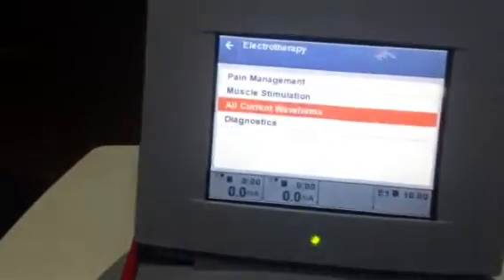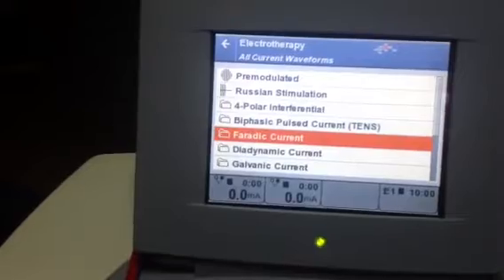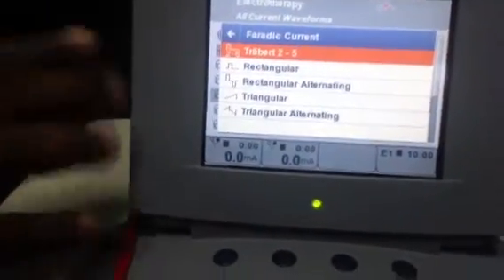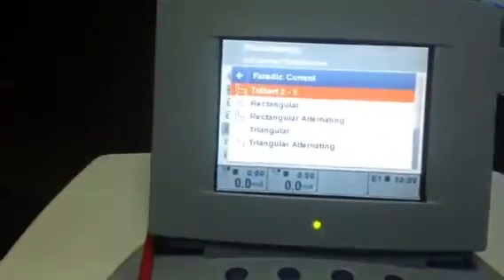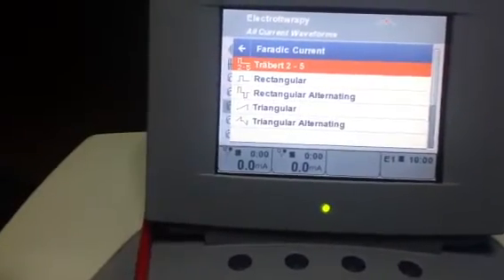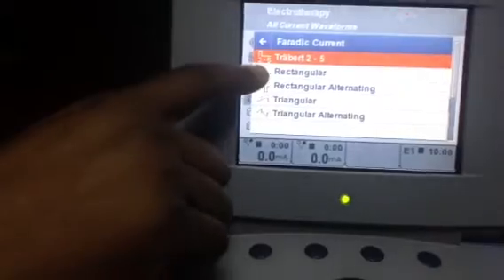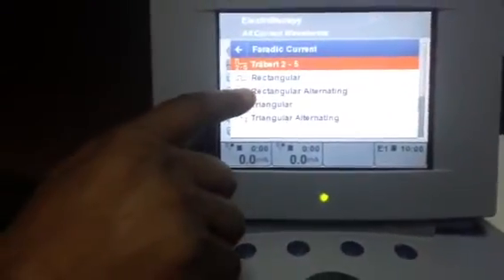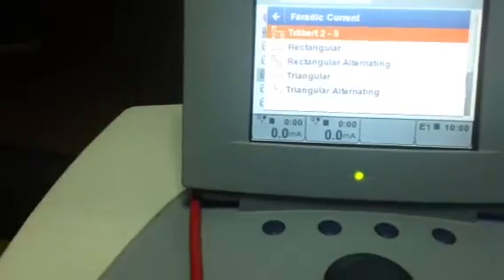Now we will select a current to demonstrate. Go to All Current Waveforms and select Faradic current. In Faradic, you have five types: Direct (also called Trebert current), Rectangular Direct, Rectangular Alternating, Triangular Direct, and Triangular Alternating.